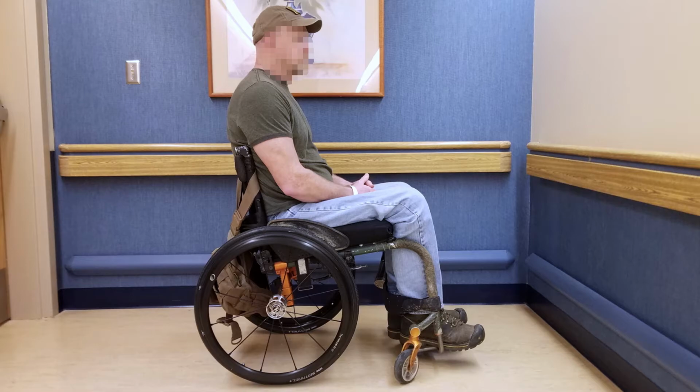So he lives in wild and wonderful West Virginia, and he is basically a shepherd on a hill in a wheelchair. So if we moved his axle forward, can he get up the hill? Probably not. What happens when he came to see Steve? I don't really remember the reasons, but they ended up ordering a rigid backrest.